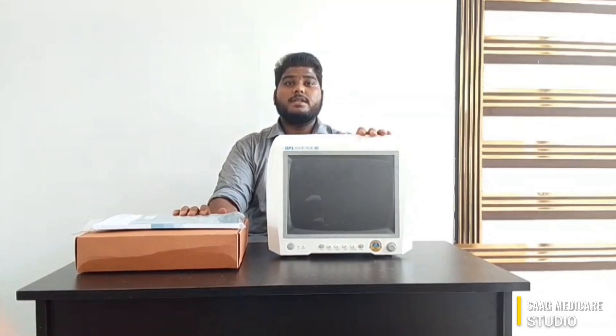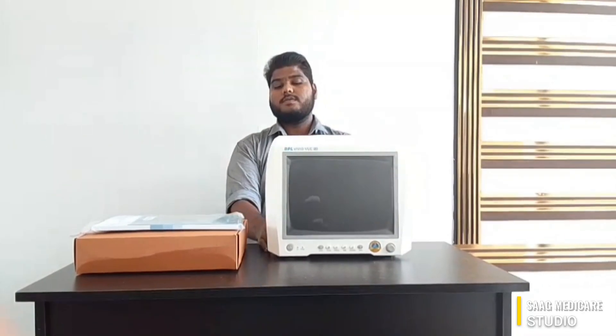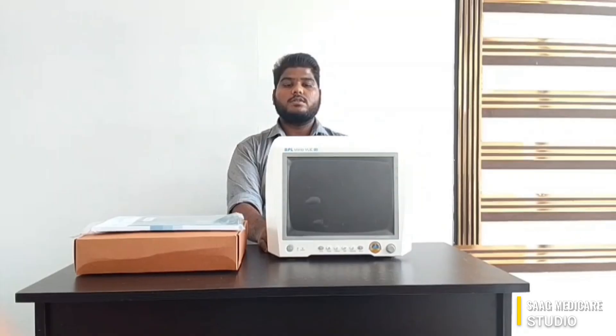Hello everyone, welcome to SAAG Medicare. My name is Richard and in today's session we will be discussing about BPL Vivid Vue 12i, a multi-parameter monitor. So without any further delay, let's move on to unboxing and see the device's specifications.